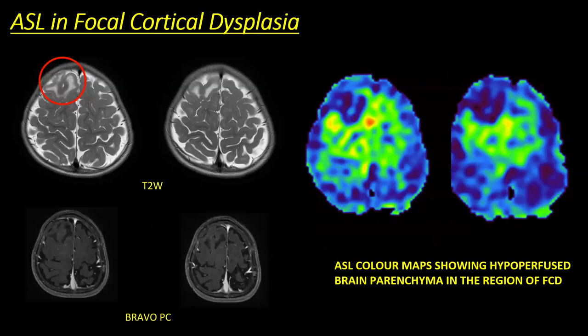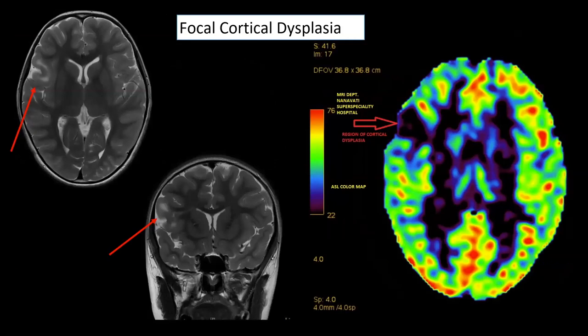Another example where the routine T2-weighted images show the actual cause of seizure in the form of focal cortical dysplasia, and the corresponding ASL color maps show hypoperfusion in this region. Another example with a small focal cortical dysplasia as the cause of seizures — though the spatial resolution of ASL is low compared to conventional MRI sequences, we can still see the small area as hypoperfused in the post-ictal phase, making our diagnosis more confident.